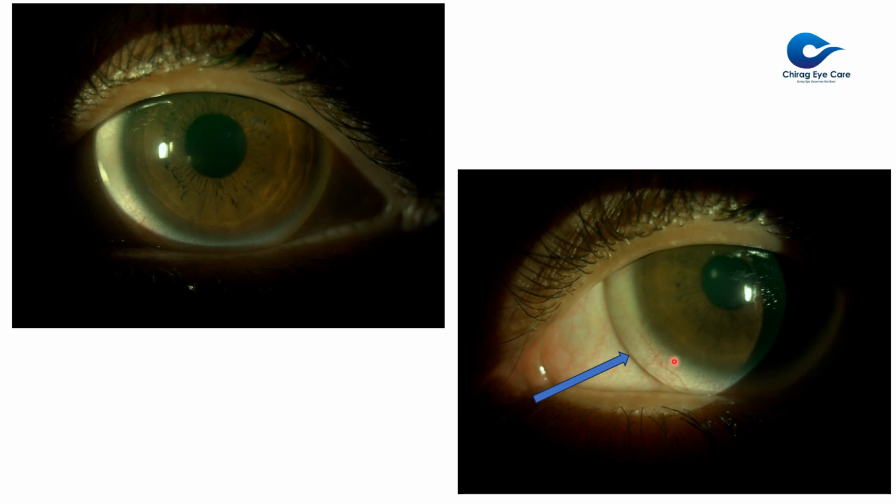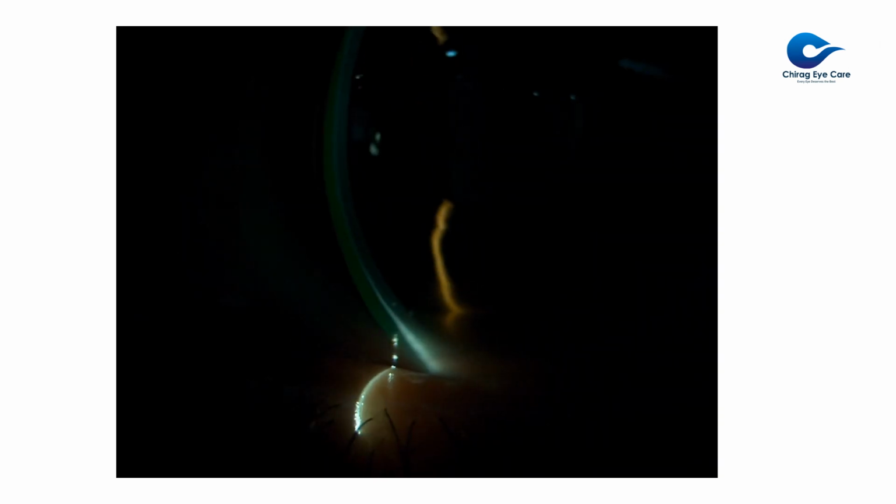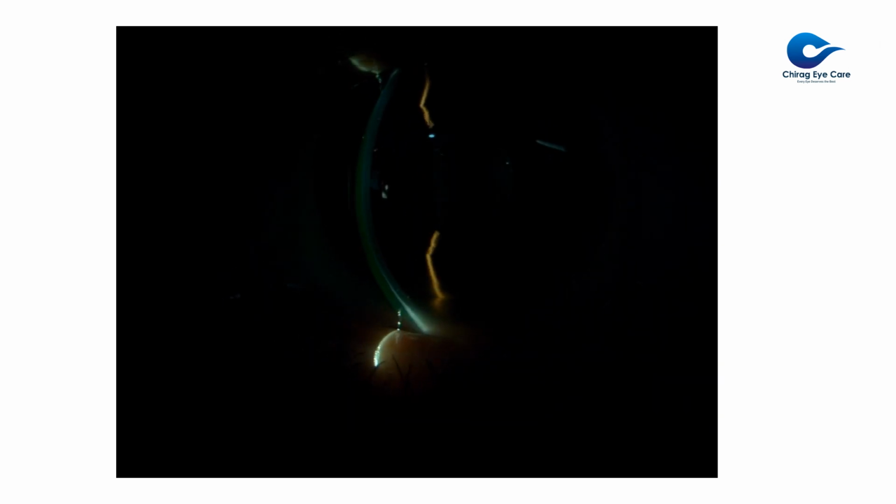Other than the vessels, you need to check for the vault. So this is what a vault looks like. This is again taken on my slit lamp, and I'm moving from nasal to temporal. You can see the green colored fluid between the cornea and the lens back surface. So that is what is known as a vault. A good vault should at least be 250 microns, if not more. I deliberately chose a higher vault for this patient in view of the advanced keratoconus and the possibility of progression in the future.